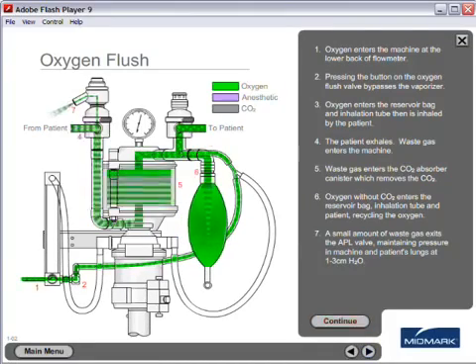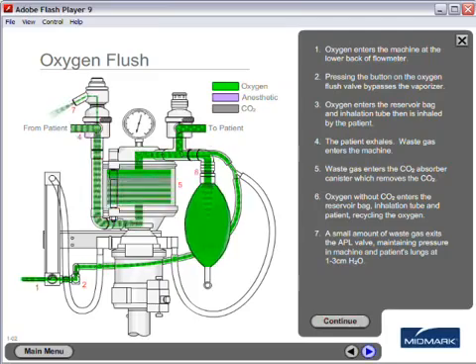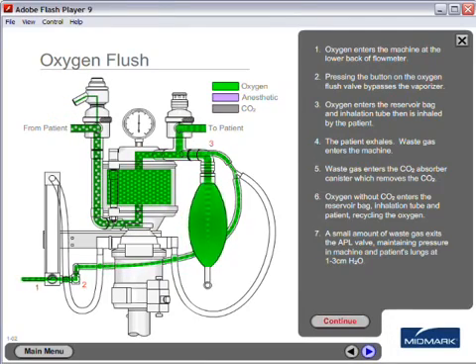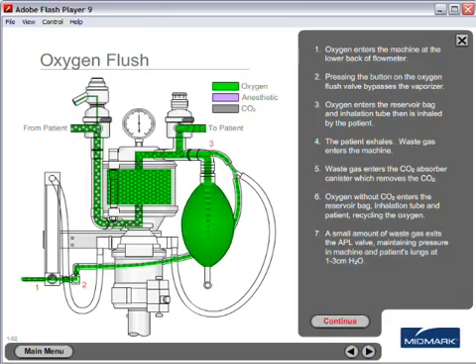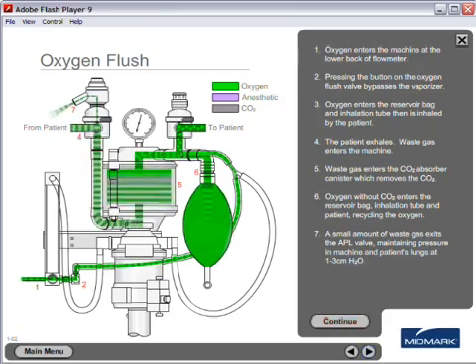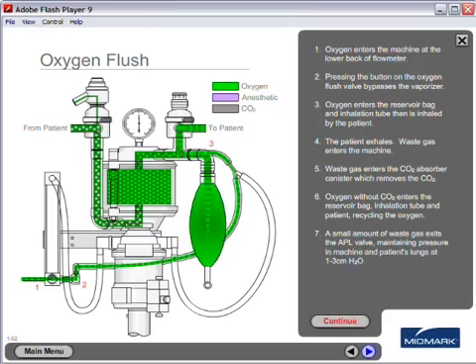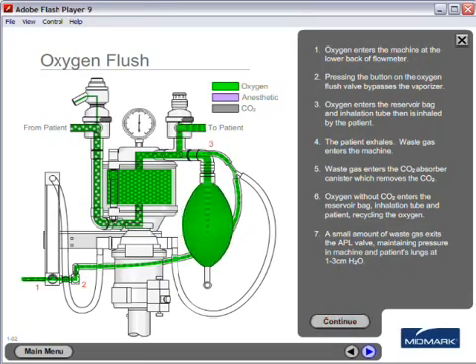Oxygen flush. Number one, oxygen enters the machine at the lower back of the flow meter. Number two, pressing the button on the oxygen flush valve bypasses the vaporizer. Number three, oxygen enters the reservoir bag and inhalation tube, then is inhaled by the patient.